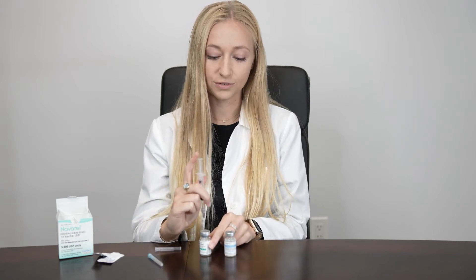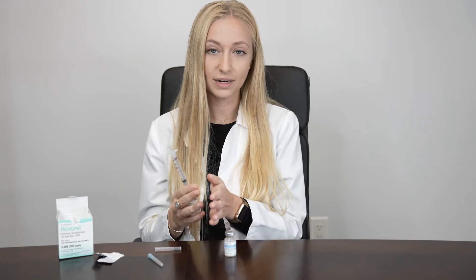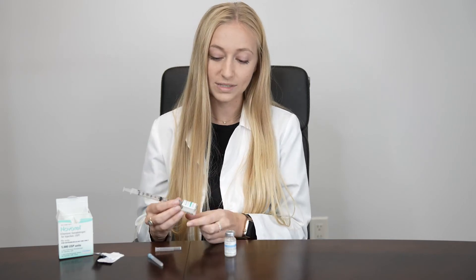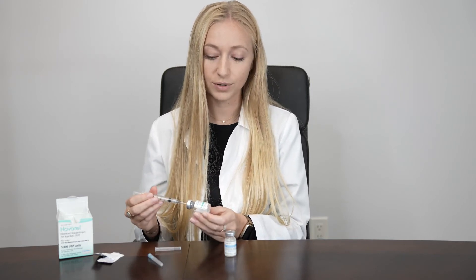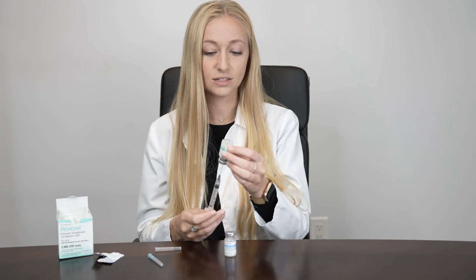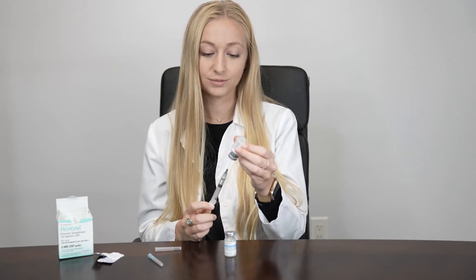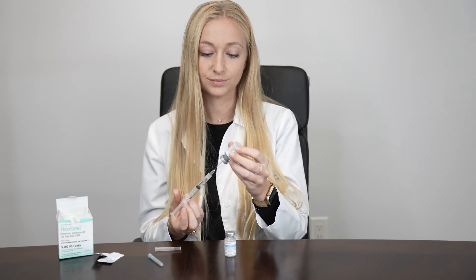Inject slowly into your vial of powder. Then gently roll the medication in between your hands until all the medication is dissolved within the liquid. Once everything is totally dissolved, flip your vial upside down, ensuring that the tip of your needle is submerged in the liquid, and pull everything out. You should have an empty vial.